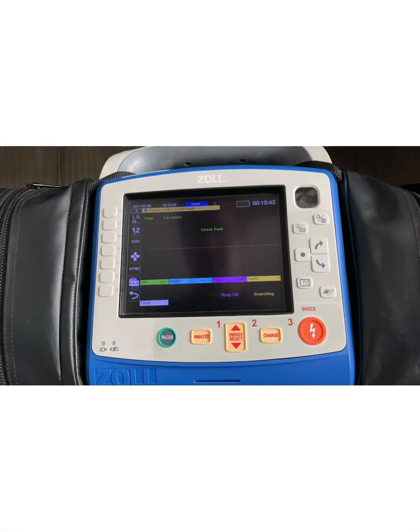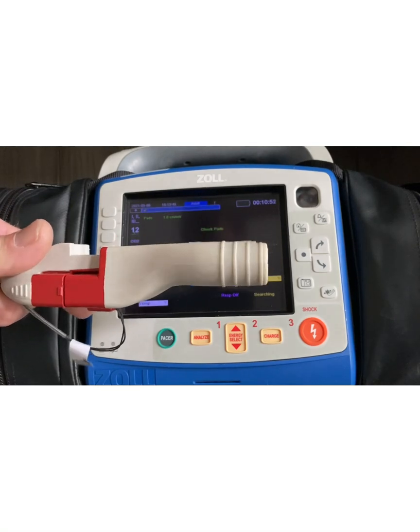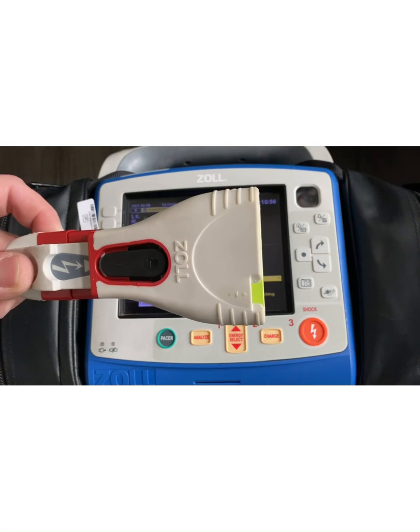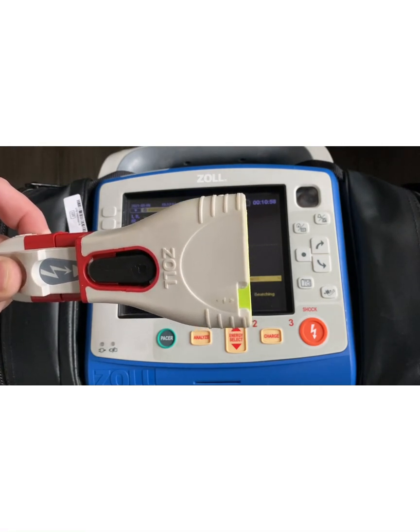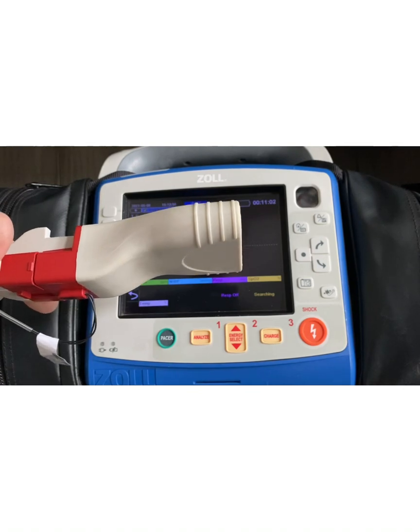The first step in determining pad compatibility is figuring out what type of defib cable you have on your X-Series. This cable, called a one-step cable and adapter, is considered a universal cable. It's going to be able to accommodate any Zoll branded pad that you'd come across.